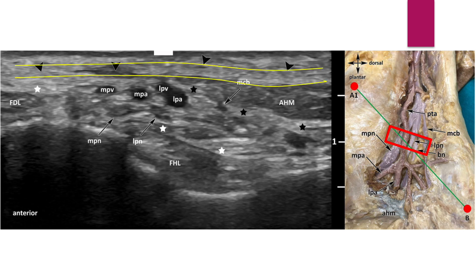The yellow line indicates the superficial and deep layers of the retinaculum. The yellow line indicates the medial septum. These circles indicate the medial and lateral plantar veins. These circles indicate the medial and lateral plantar nerves, Baxter's nerve, and the medial calcaneal nerve.